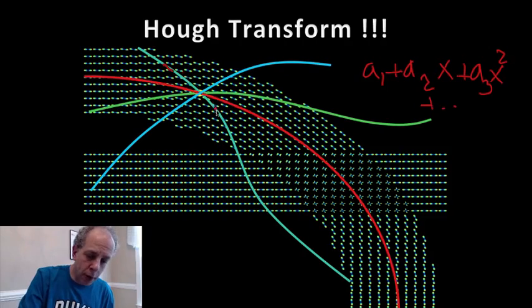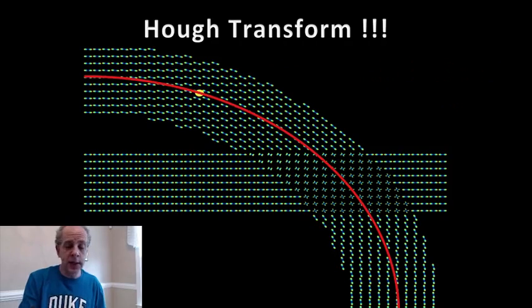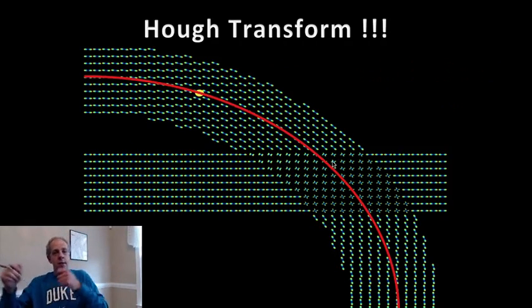So you go and vote and vote and vote. And then you take another one and you vote and you pick the curve that has the maximal vote. So you say, this is the one that most of it, or at least the majority, or in a very strong case, the tangents go in the direction that the voxels tell me there is a high probability of going in that direction, a fiber or a cable, as we have been saying.